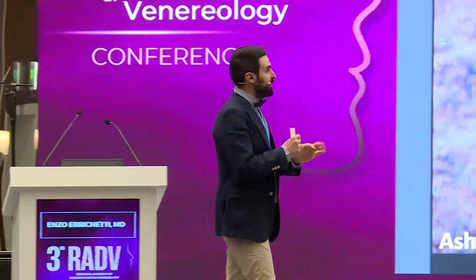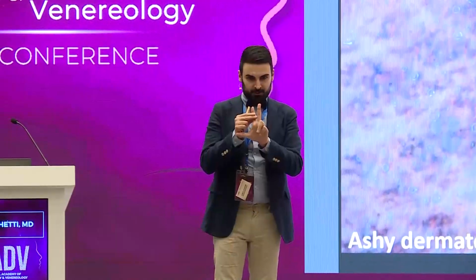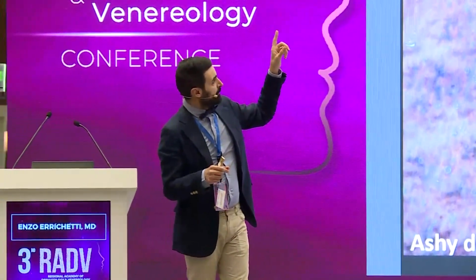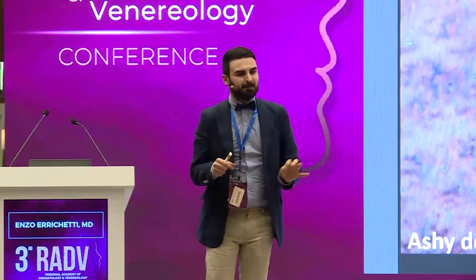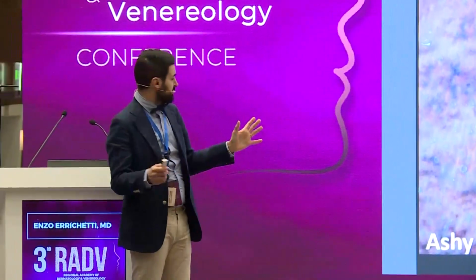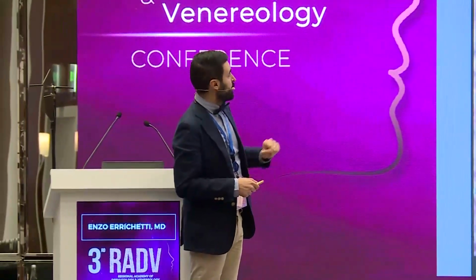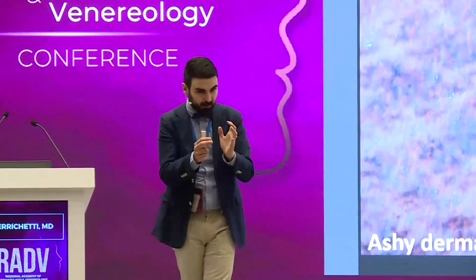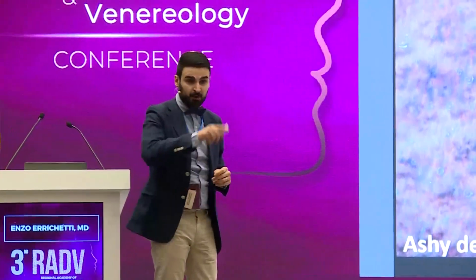We basically have three groups of conditions. The first one includes facial pigmented dermatoses characterized by dots, and we have three conditions. Ashy dermatosis, in which the color of the dots is blue-gray, and the arrangement is around the follicles.